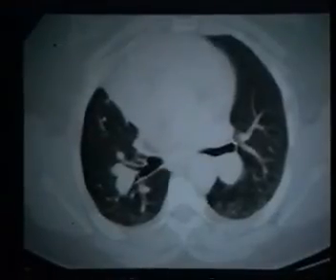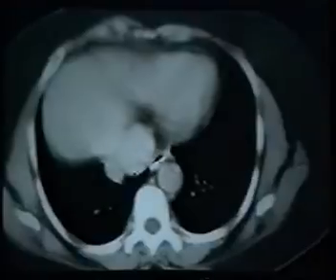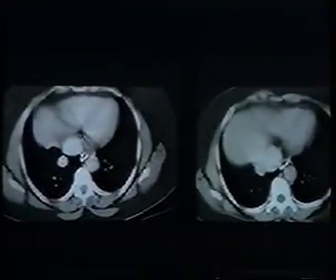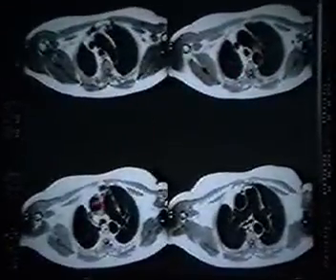And in fact, at the right lung base, we can see these large anomalous vessels, which we can track down into the inferior vena cava, and we make an unequivocal diagnosis of scimitar syndrome. And we can look at this with MR as well. Here you can see there's a hypoinflated or hypoplastic right lung.